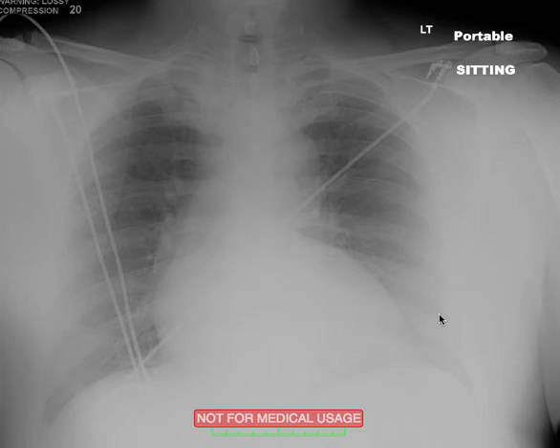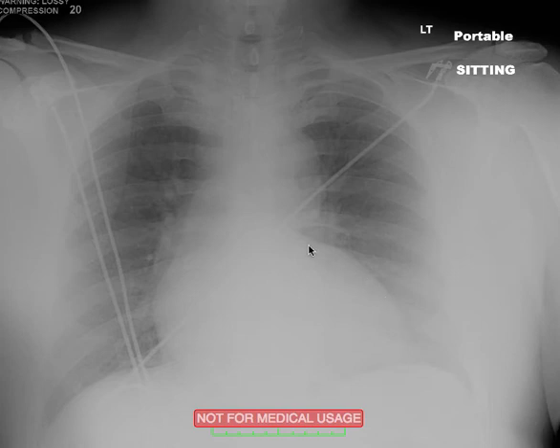Frontal chest radiograph, or frontal image, is a generic term that basically means it could be AP or PA, depending on the projection. Most portables are going to be AP projection, which gives you more magnification of the mediastinum than a PA chest would.